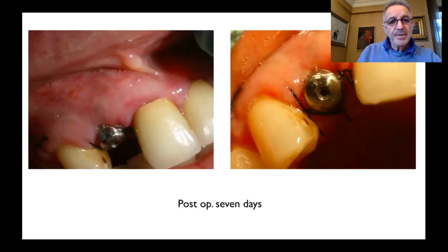This is post-op 7 days. As you can see here, it looks pretty okay for 7 days. There was a lot of things I did: I made an extraction, disinfection, and sandwich augmentation, and in 1 week, as you can see here, it looks pretty okay.